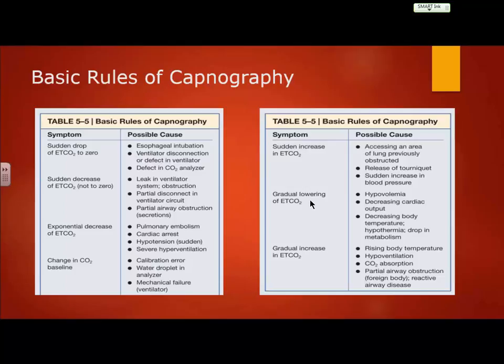If I've been bagging, we've got a good waveform, and suddenly it drops, now I know I need to assess my patient. What's the first thing I'm going to listen to? I'm going to check lung sounds first, then I'm going right to the guts, right? Then I'm going to check compliance, then chest rise and fall. Then I'm going to look at, does this 70-year-old man suddenly look like he is 36 weeks pregnant? That happens. That stomach will get really big, all right?